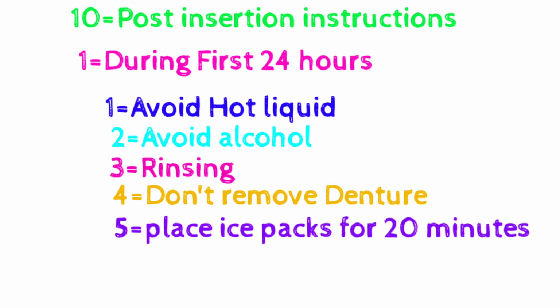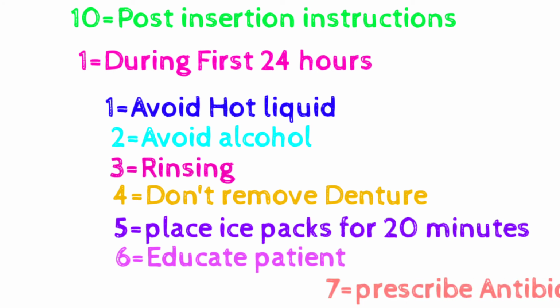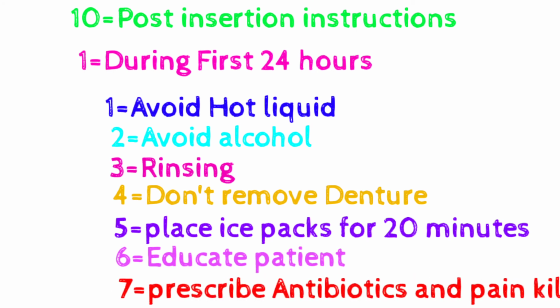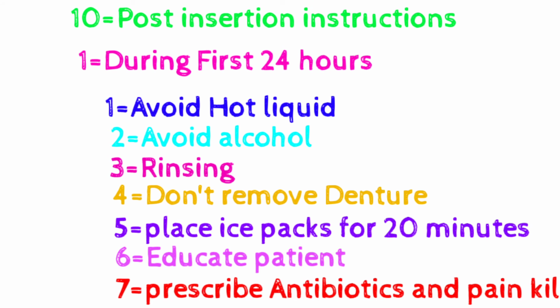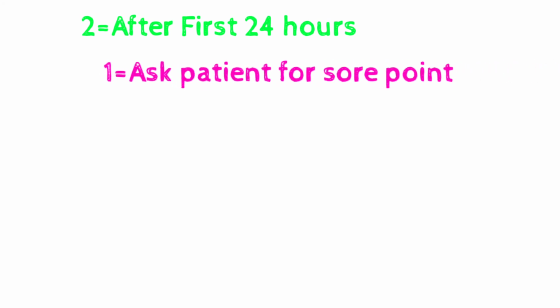reinsertion will be difficult. Number 5, place ice packs for 20 minutes to decrease the swelling. And number 6, educate patient. Number 7, prescribe antibiotic and pain killer to the patient, and educate patient because patient thinks the pain is due to denture, so they remove the denture. We should educate the patient the pain is due to extraction of tooth, not due to denture.